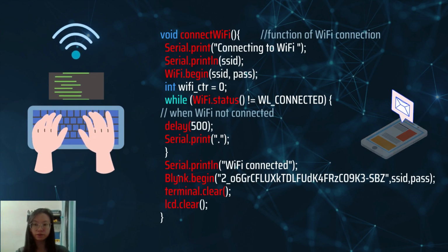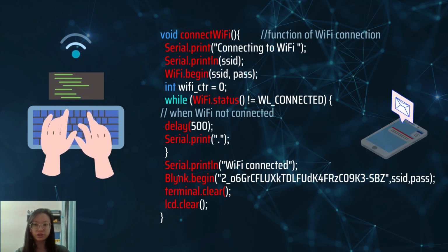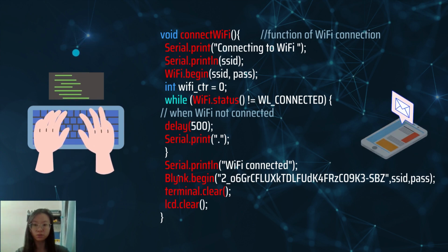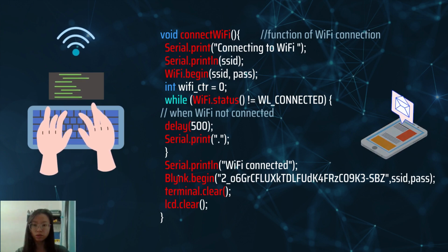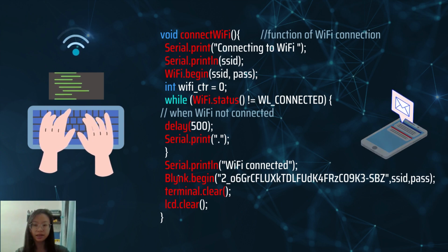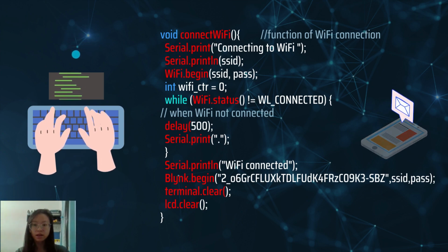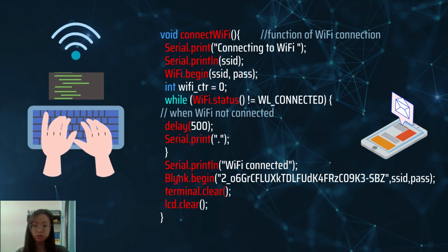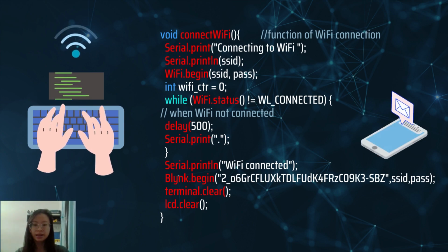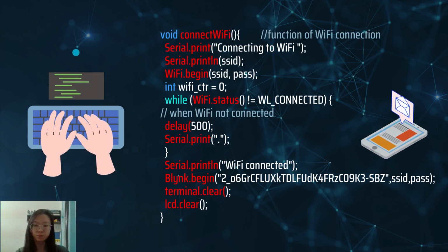Inside the connect Wi-Fi function, WiFi.begin(ssid, pass) is to initiate a connection to the Wi-Fi network. Next, a while function will execute when Wi-Fi is not connected. It waits for 500 milliseconds and prints a dot to the serial monitor. Indicates that it is still trying to connect. Once the connection is established, the function prints Wi-Fi connected to the serial monitor. Finally, the function calls terminal clear and LCD clear to clear the virtual terminal and LCD display in the BLINK app.